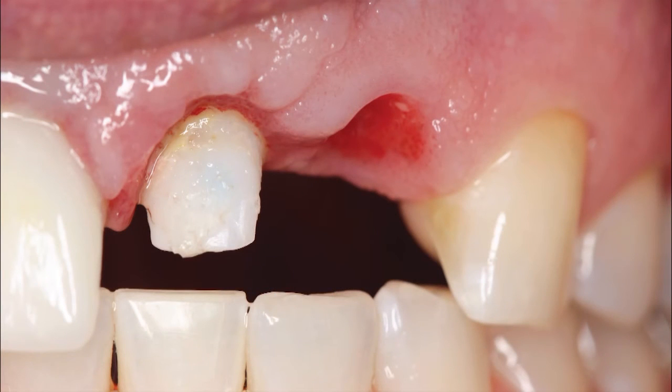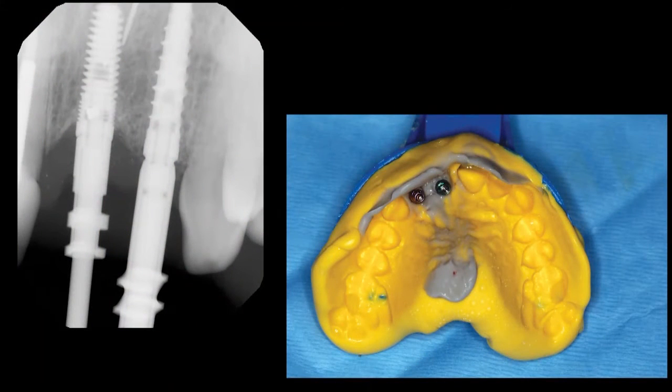After the healing period, nicely formed soft tissue contours were revealed in the interdental papilla. An open tray final impression was taken with medium and heavy body vinyl polysiloxane materials after placing open tray impression copings, the complete seating of which was verified radiographically. The conical connection of the Hahn tapered implant allows for excellent seal, stability, and strength.